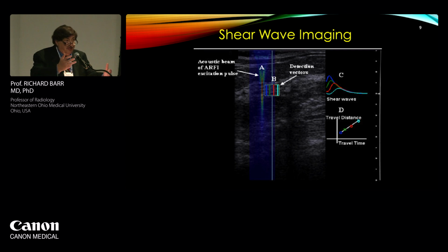And I really want to thank Canon. They're one of the systems that we have proof that the cutoff values work on their system. So that's really important. And we're hoping that all the other ultrasound vendors will be able to get to the point where their machines all work with the SRU cutoff values.